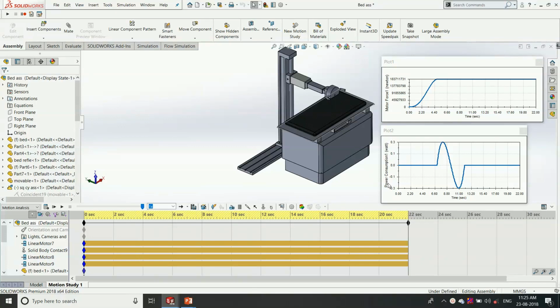and we can get what the power consumption of that particular motor is. So through this analysis we can choose whether the process needs any advanced kind of motor or whether the existing motor is enough to perform well for the required operations.